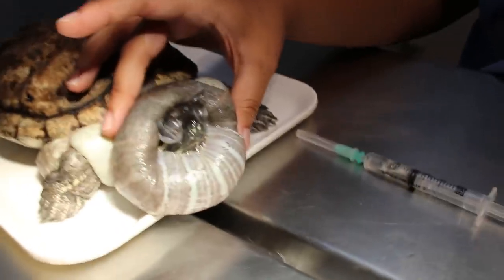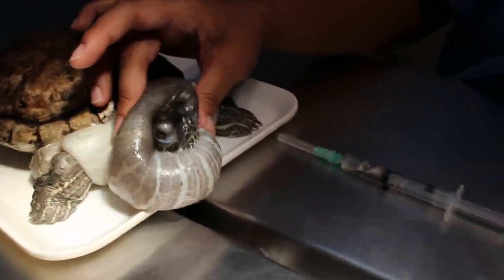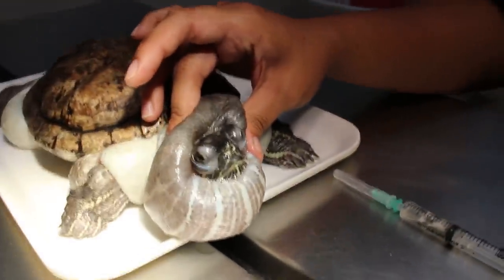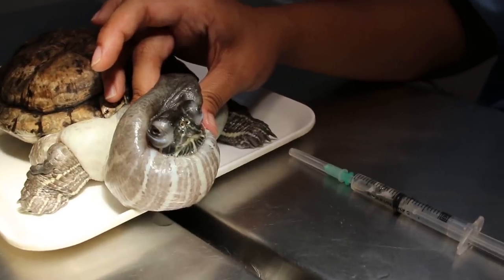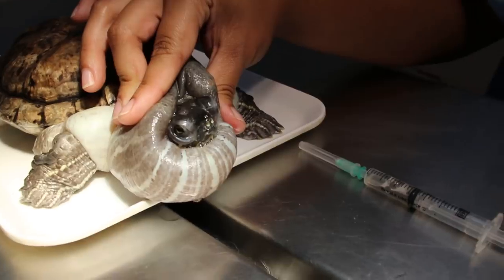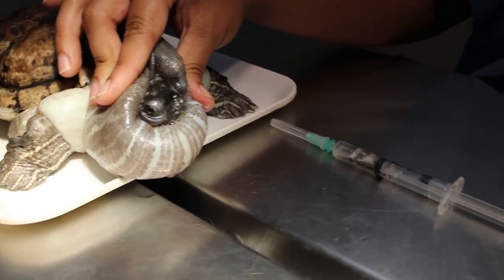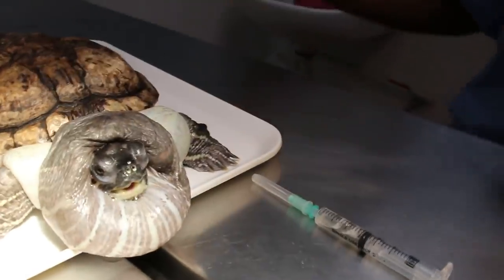Express it out there — so it feels better. Now these are the fluids from edema, due to leakage from the blood vessels. The best is take a container and collect the fluid.